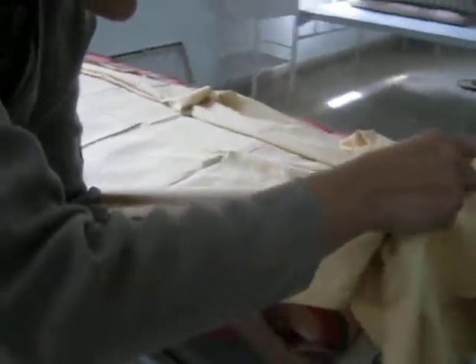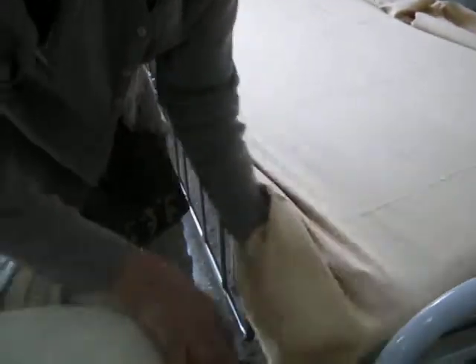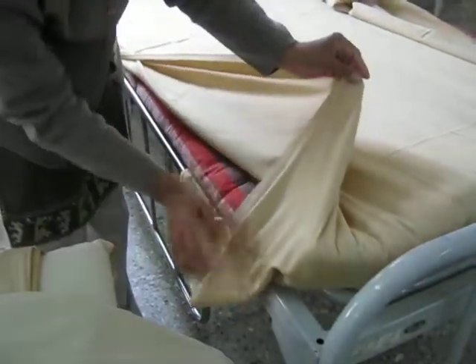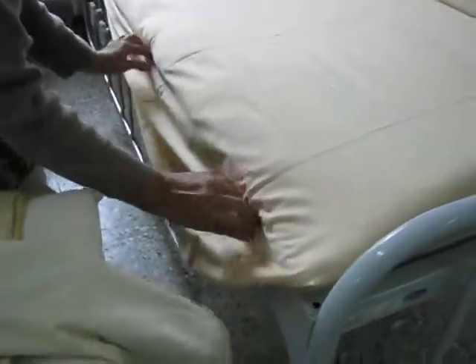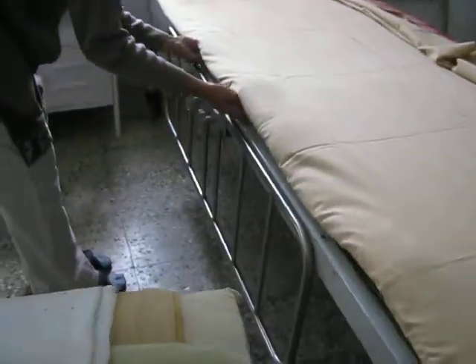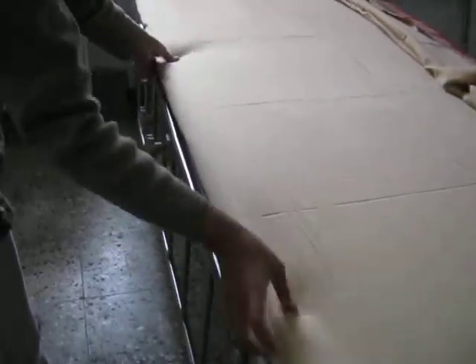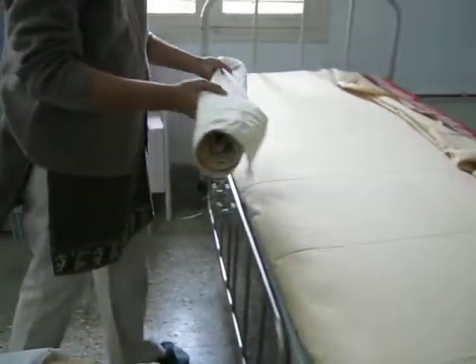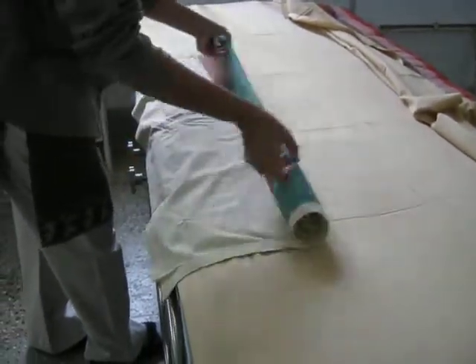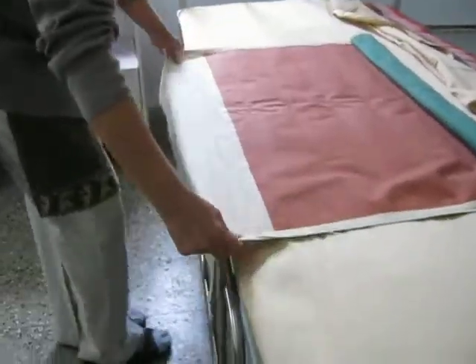Then go to the foot end of the bed and tuck in the same way. Again we are going to make a mitered corner. While doing the bed, you maintain your position and use your long muscles so that you don't get tired. We are not going to go around the bed, so first we will finish on one side and then only we will go to the next side.